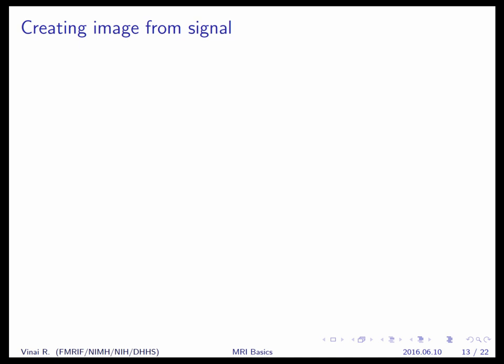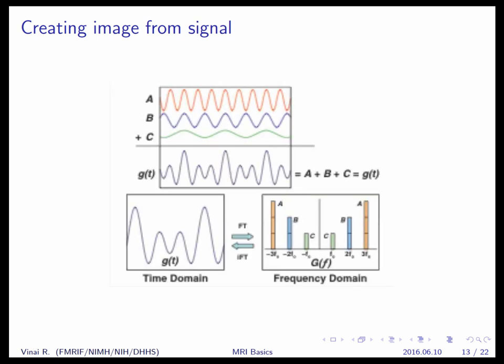And conveniently, there's actually a whole branch of math dealing with this problem. So if you have things with different frequencies all transmitting together, you get something that looks like this. That doesn't really look like any of these completely, but has some properties.